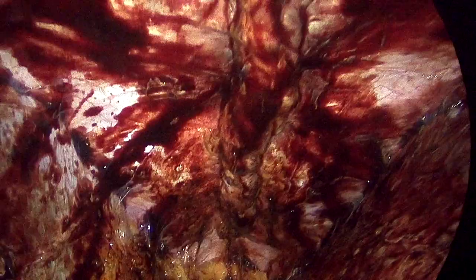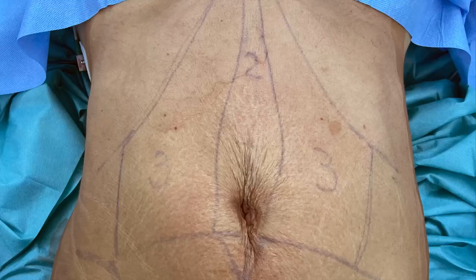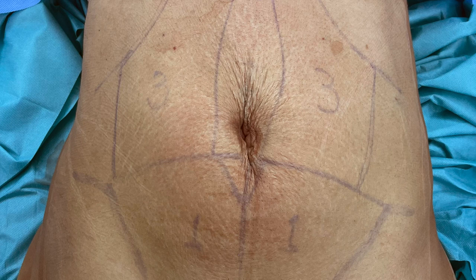Now it's just time to place the mesh. This is a 15 by 25 simple middleweight polypropylene mesh, which re-inflates the cavity and everything is laying very nicely. This is the final result — the umbilical scar will improve, and we did all of this procedure through three small incisions hidden in the pelvis. Thank you very much for watching.